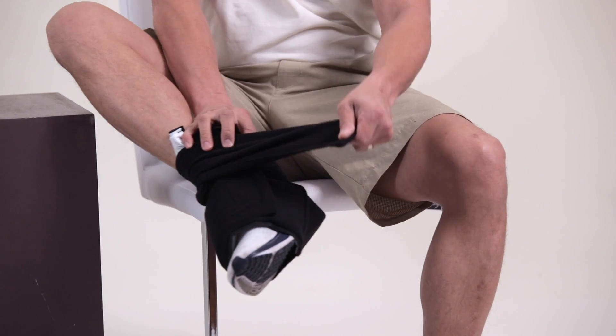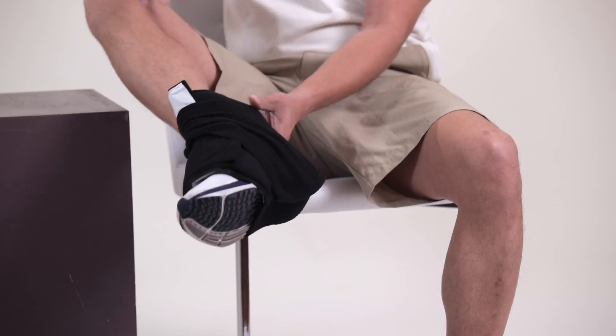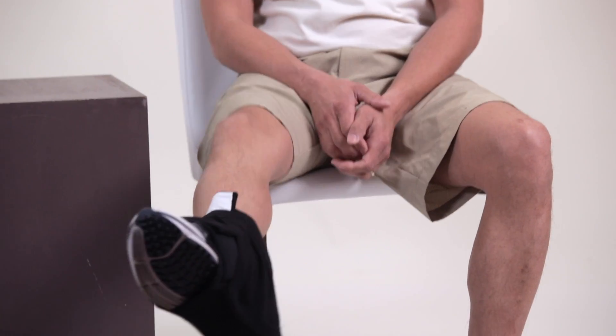Or we can take this strap and strap it right onto the other like this, so it almost becomes one piece.